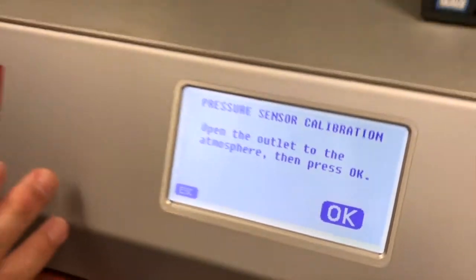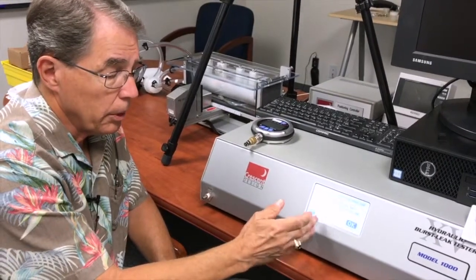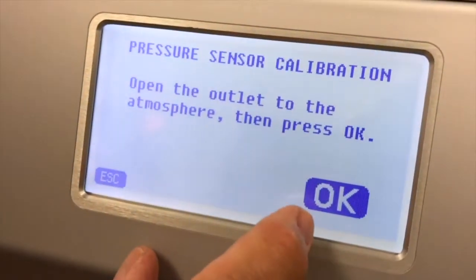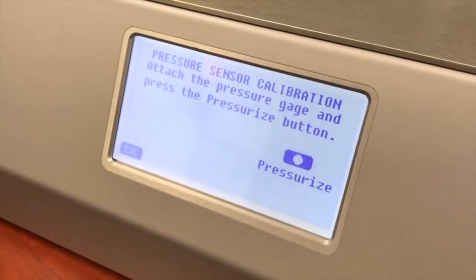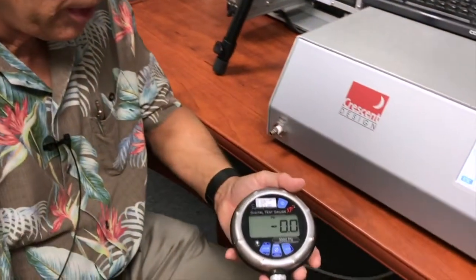Now there's a series of instructions that will help you calibrate the HBLT. Here it says open the outlet to the atmosphere and then press OK. It's open as we can see over here, so I'll hit OK and we're ready to pressurize. Now we're going to use a digital pressure gauge.